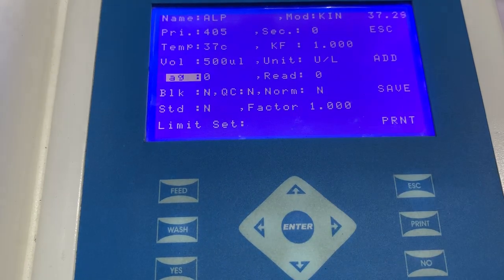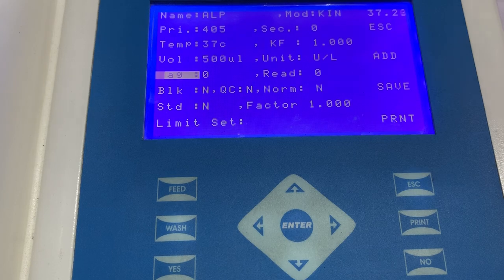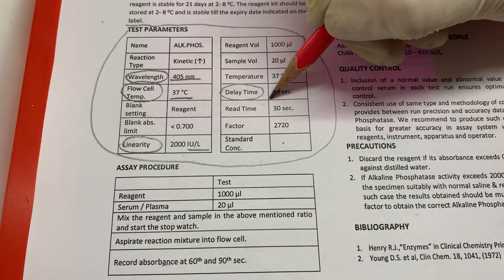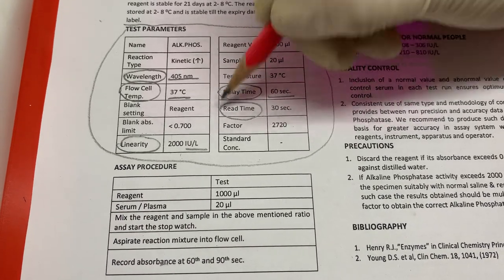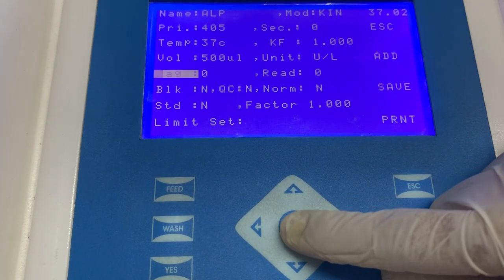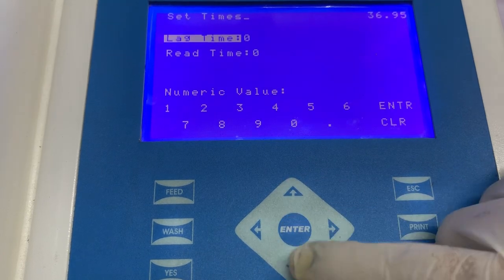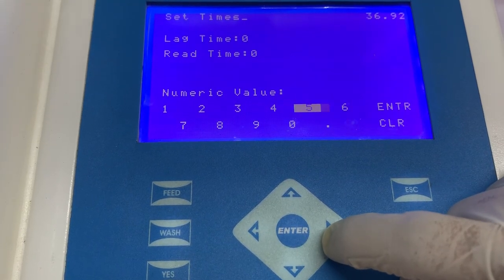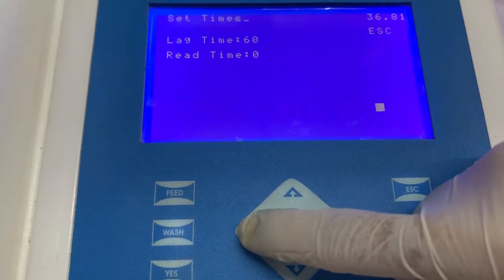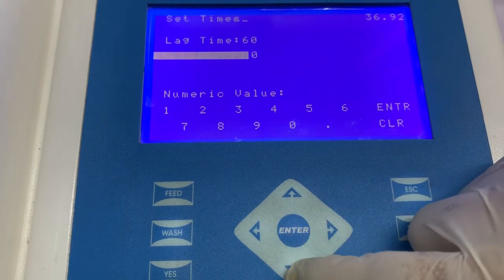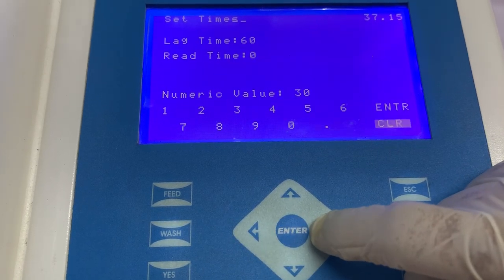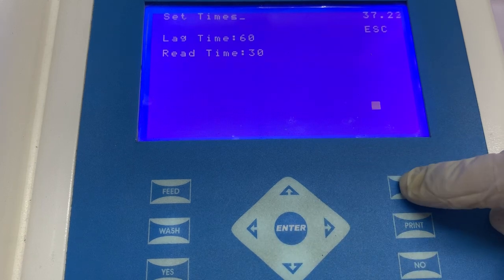The next information that needs to be added is lag time or delay time, and read time. Again, this information can be seen in the instructions for use, where the manufacturer mentions what is the delay time or lag time and what is the read time. To enter this value, select the option of lag time and enter the numerical value seen in the instructions for use and press enter. Then select the option of read time, enter the numerical value seen in the instructions for use, and press enter and escape to come back to the home screen.